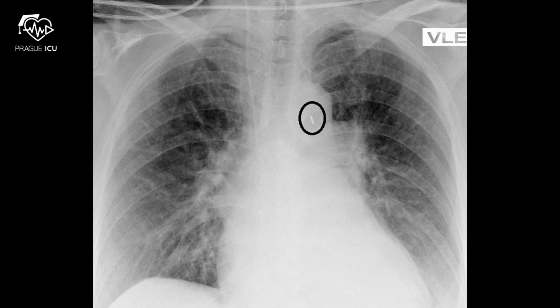Balloon should be positioned so that the tip is about 1 to 2 centimeters distal to the origin of the subclavian artery visualized on TOE.